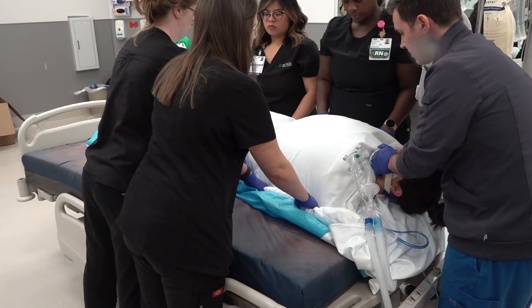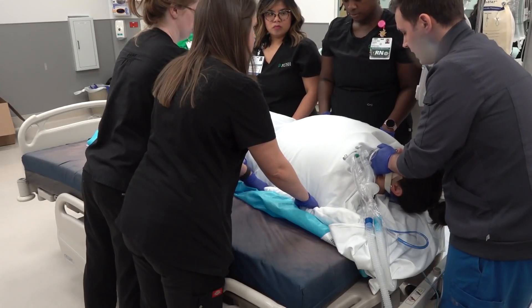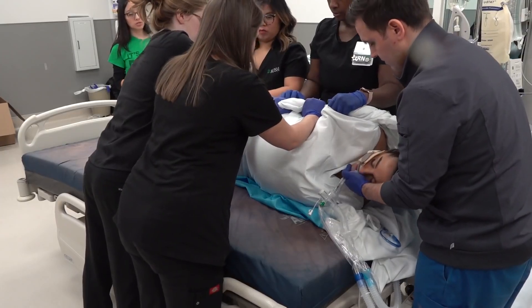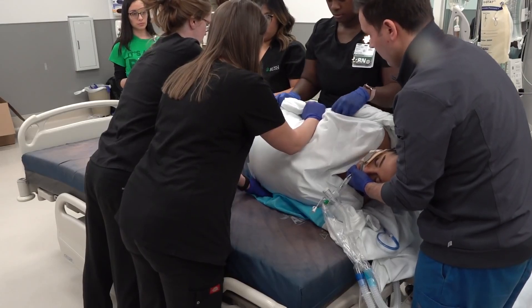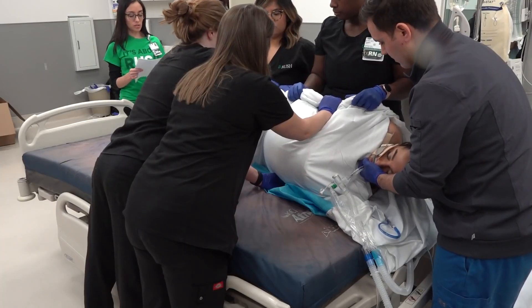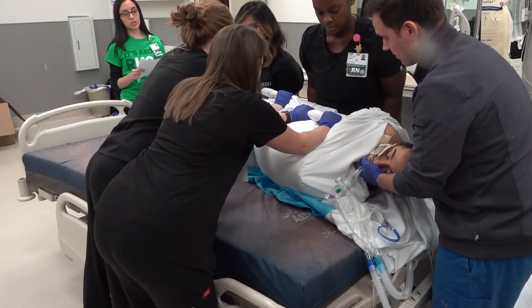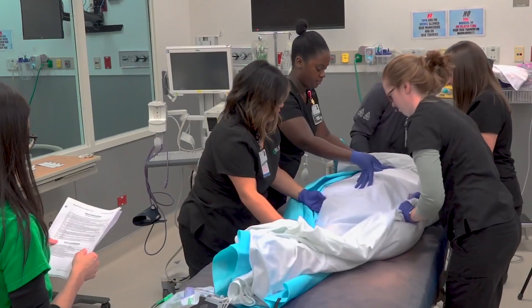On the RT's count of three, the patient will be rotated 90 degrees to the sideline position. On the RT's count of three, the patient will be slid horizontally away from the ventilator. On the RT's count of three, the nurses opposite the ventilator will pull the rolled-up sheets from beneath the patient while the other nurses carefully place the patient into the prone position.